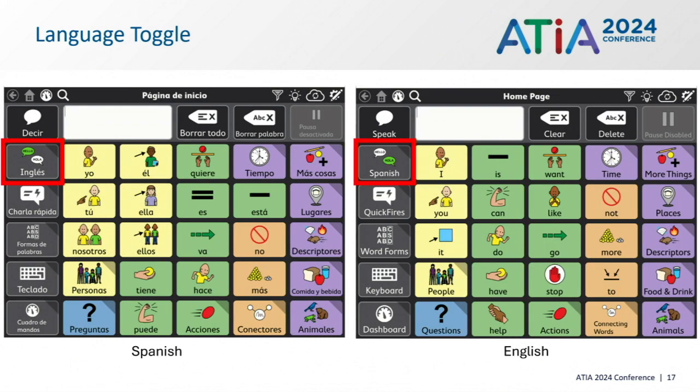So you can see here up on the screen, we've highlighted in red. This is where your toggle is going to be back and forth. So this is how I toggle between English and Spanish. So it is important to note here that the primary language and the language that this page set was based upon is Spanish. So that's the primary language when we're talking about this bilingual page set. So the dashboard will be in Spanish, and you're toggling back and forth in the English language.